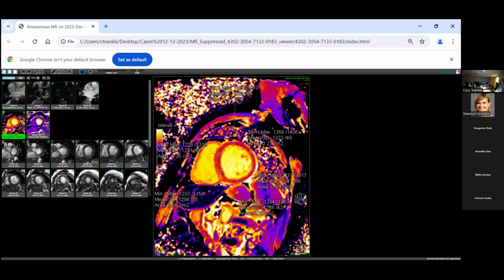We just know something's wrong. We're going to have to use other parts of the image, and we're going to talk about that in a different lecture. But this is a nice example of how we use the T1s. Okay, can we go back to the whiteboard? Now, we've got to figure out how in the world we made that picture.